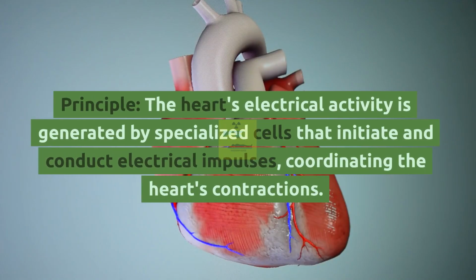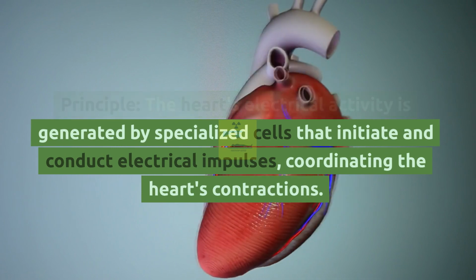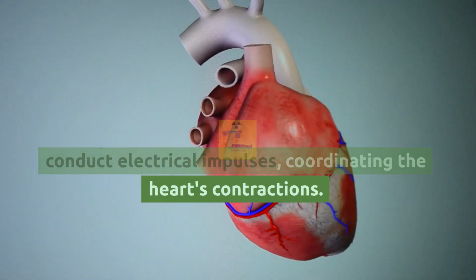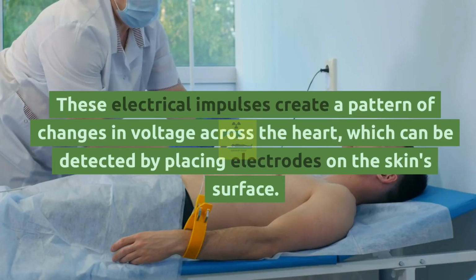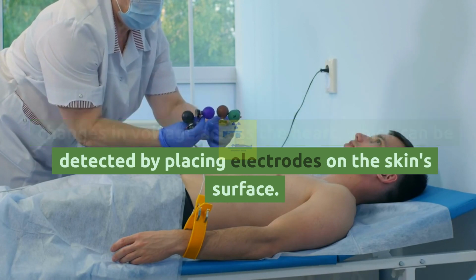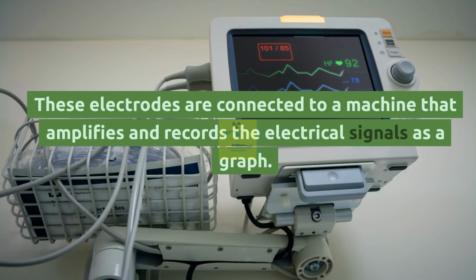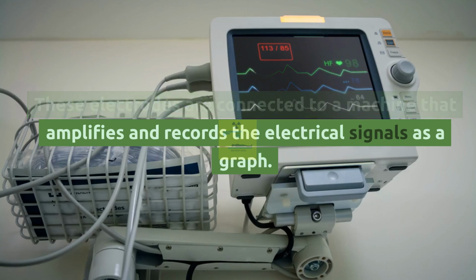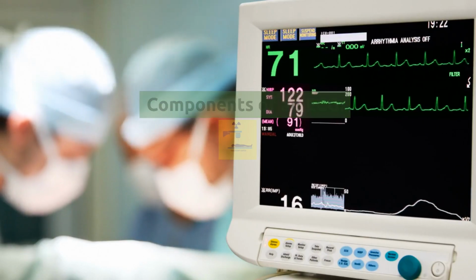Principle: the heart's electrical activity is generated by specialized cells that initiate and conduct electrical impulses, coordinating the heart's contractions. These electrical impulses create a pattern of changes in voltage across the heart, which can be detected by placing electrodes on the skin's surface. These electrodes are connected to a machine that amplifies and records the electrical signals as a graph.